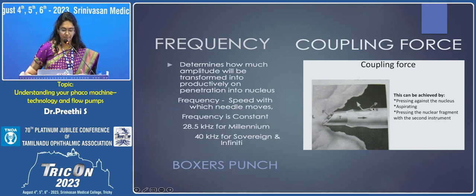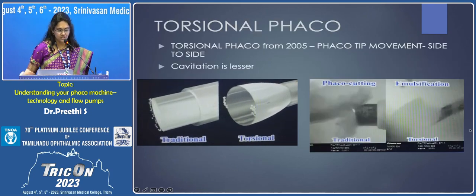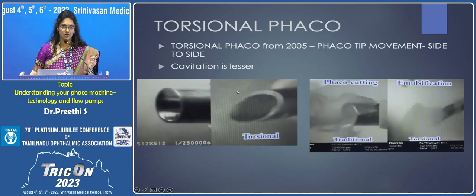And then also the coupling force. You have to be close to the person whom you punch. So the nucleus has to be brought towards the phaco tip. You can either achieve it by having good followability or you press the nuclear fragment with the second instrument. So that is the importance of having a second instrument. So this is about the cutting technology. Now I was talking about the longitudinal.